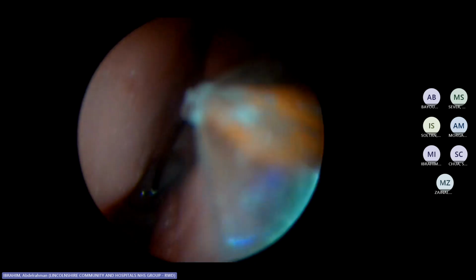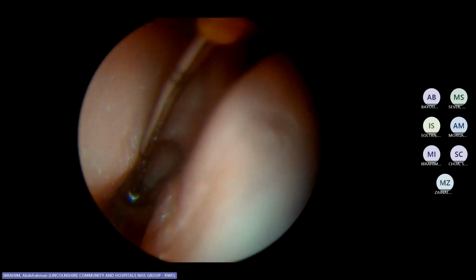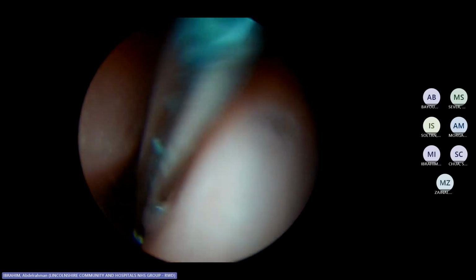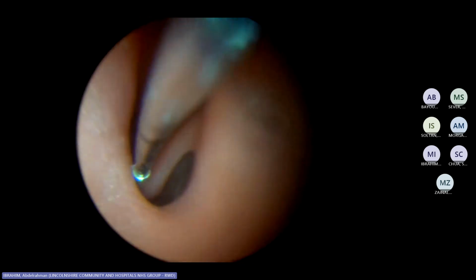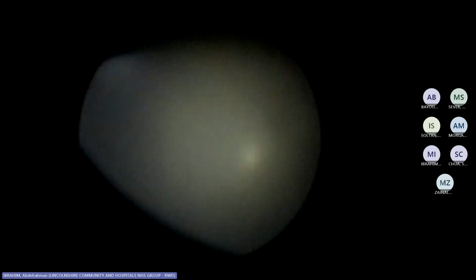Atraumatic. I see the edge with my camera. I'm not pulling it roughly. I'm not touching the turbinates. I'm very gentle going out. And then bye-bye. That's it, fine. Okay, I will show you the implant as well.